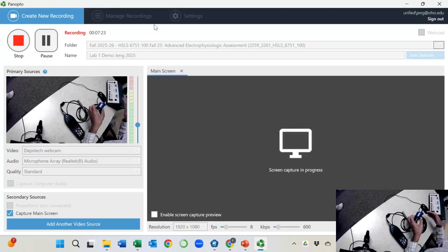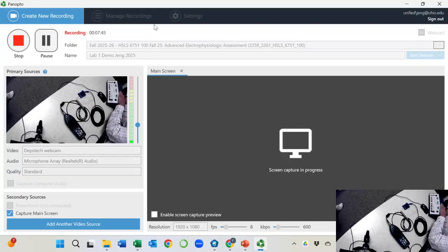I use it for demos in this lab, and I put 3 dots on it, which is my secret notation. Whenever you see any device with 3 dots on it, don't use it. It's intermittent. All right, so this is the modified insert earphone, and let's plug it into the insert left ear channel. Okay, and let's say 60 dB.